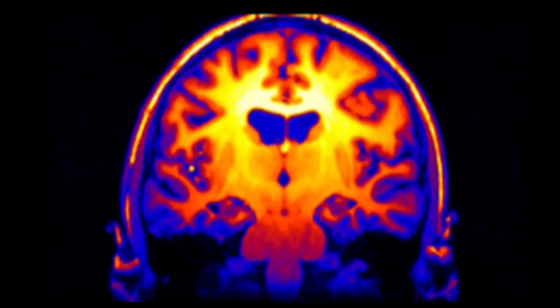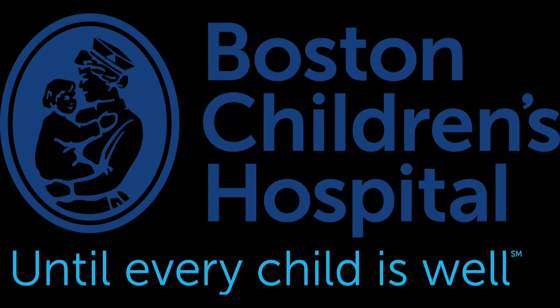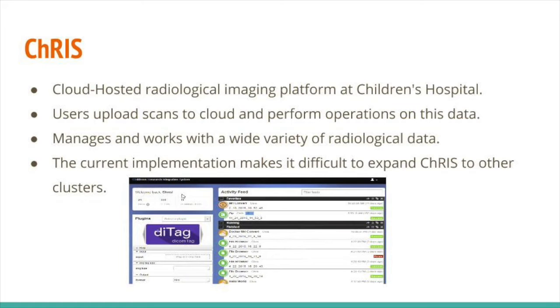In our project, we worked with the Boston Children's Hospital in the Fetal Neonatal Neuroimaging and Developmental Science Center in helping them deploy CRIS, the Children's Research Integration System. What exactly is CRIS? How does it work? And where do we fit in?